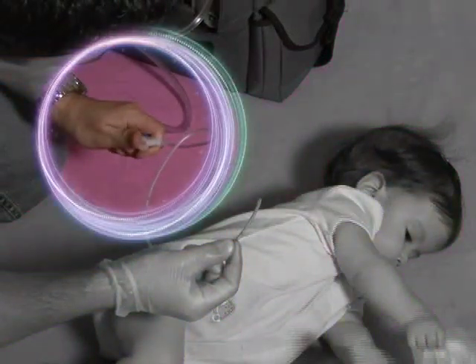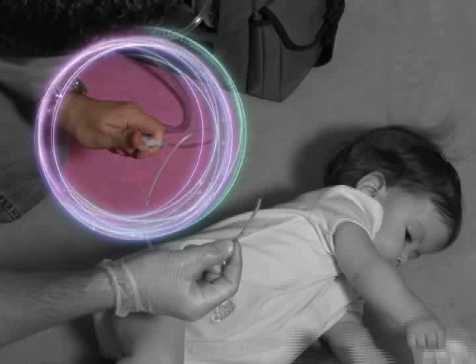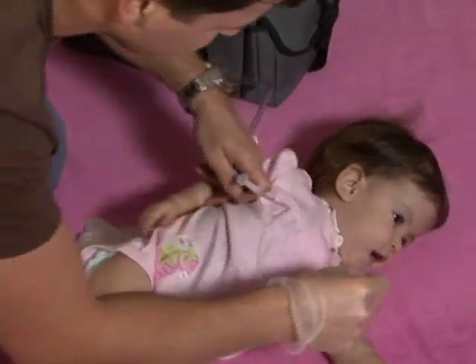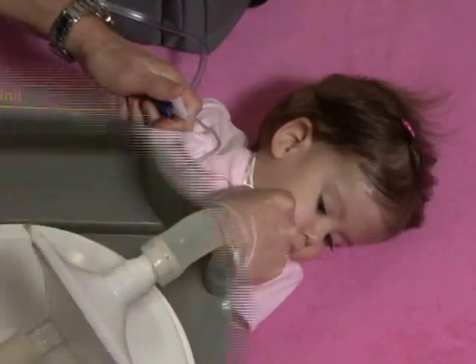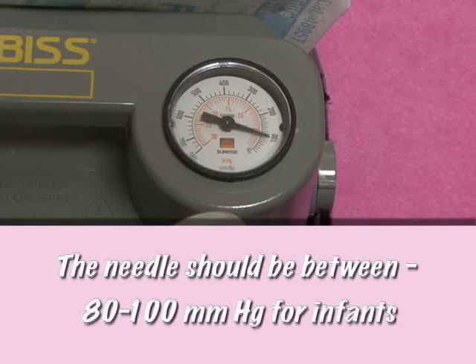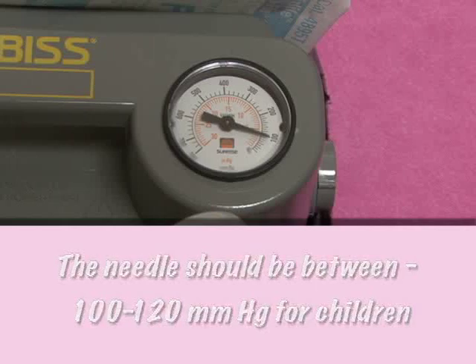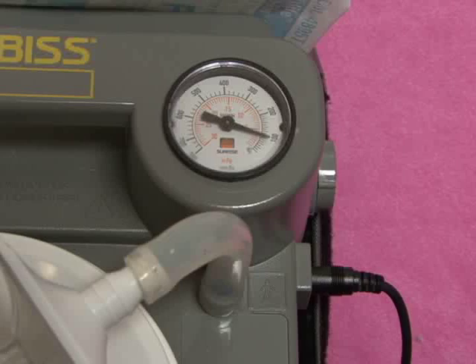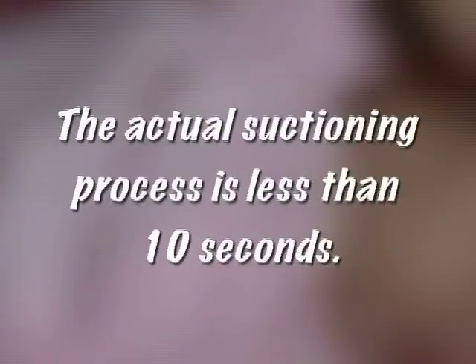With your clean hand, hold your thumb over the hole at the end of the catheter — do not press down on it yet. First, insert the catheter until you're at the desired length. Now go ahead and press your thumb over the hole. Take a quick glance at the pressure readings — the needle should be between 80 to 100 millimeters for infants and 100 to 120 millimeters for children. Be sure the needle is not above these ranges, as higher negative pressures have been shown to cause trauma. Slowly swirl around the catheter while drawing back slowly. The actual suctioning process is less than 10 seconds.